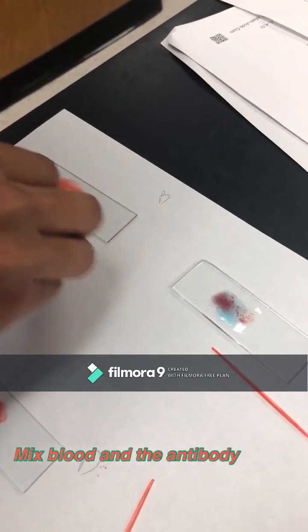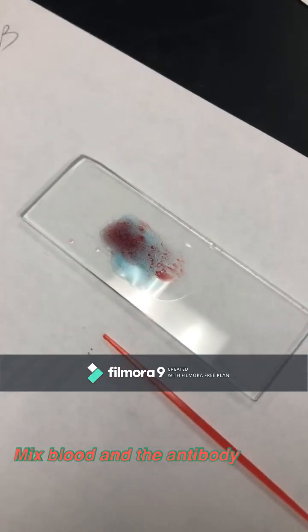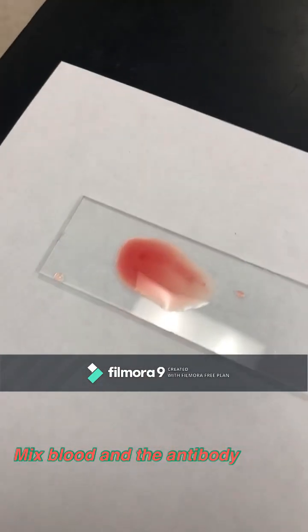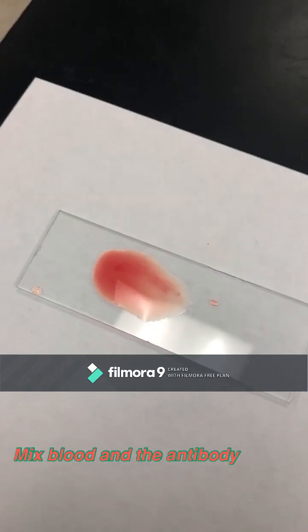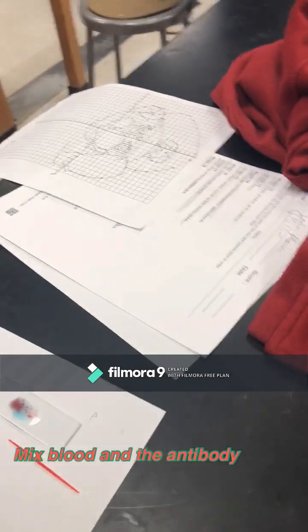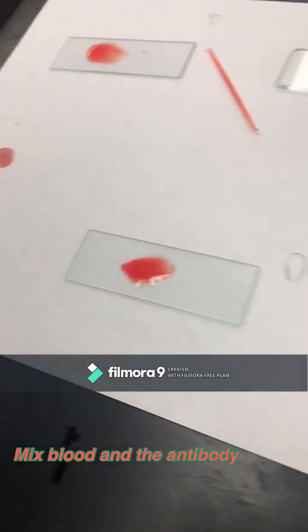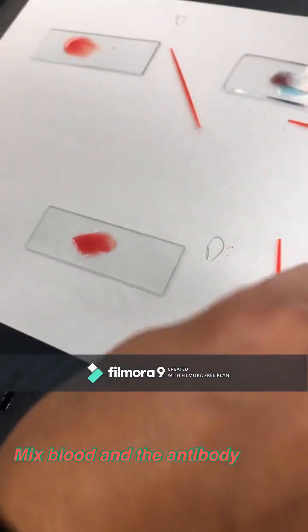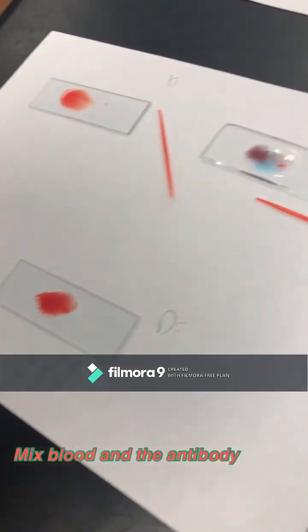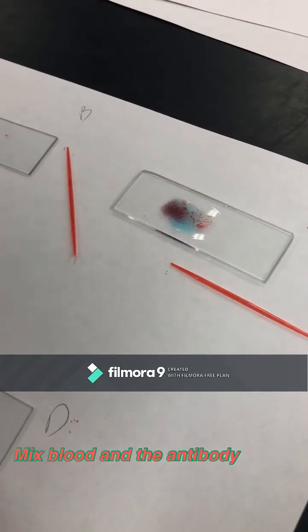Okay, so you have clumping in A — it's like a splinter, basically. No clumping on B. No clumping on A for the other sample. Let me do it for you. Check your clumping on A. Okay, see the clumping? Yeah.